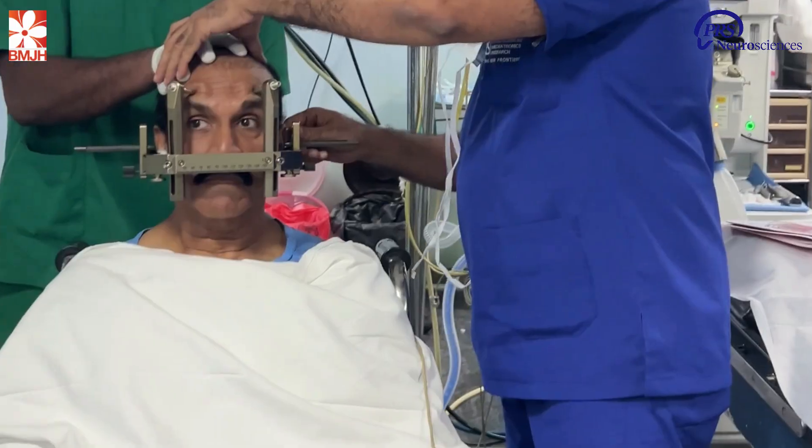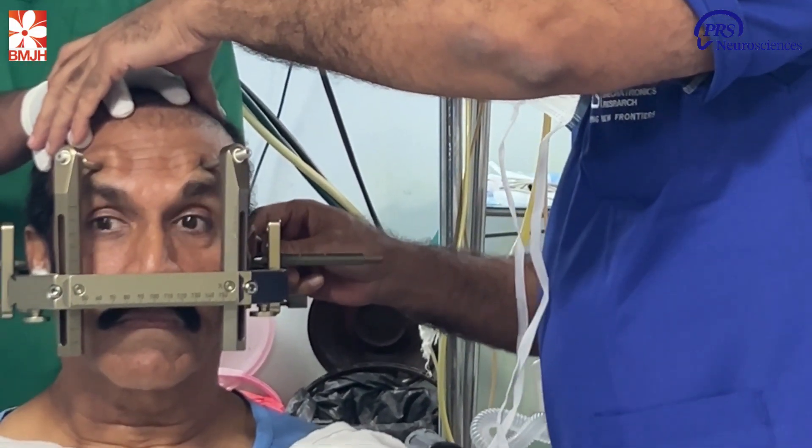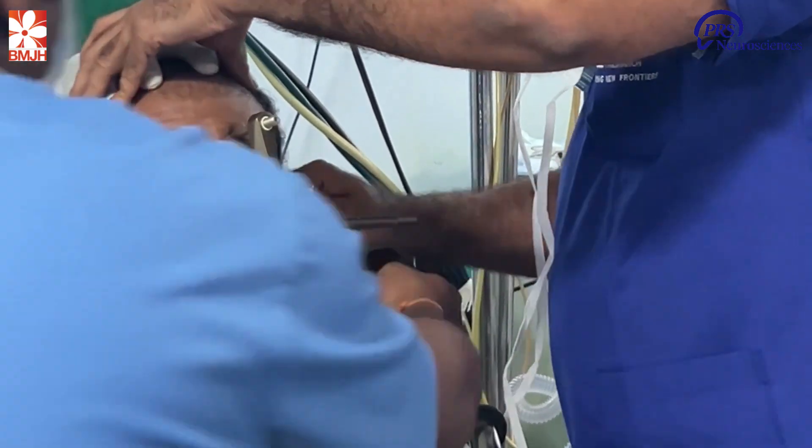This is what is called stereotactic and functional neurosurgery. This involves placing — Bhagawan Madhijayan Hospital has all the special equipment that we purchased. I had this training at Sino with my guru, Professor Takawamit Taira from Tokyo, Japan, in the year 2015. He taught me this. He is the world's best in this whole procedure. What we do is fix a special frame to the head called the stereotactic frame — two screws in the front, two screws at the back — just going into the skull under local anesthesia. After that, a special MRI is captured. That MRI comes into my software here.